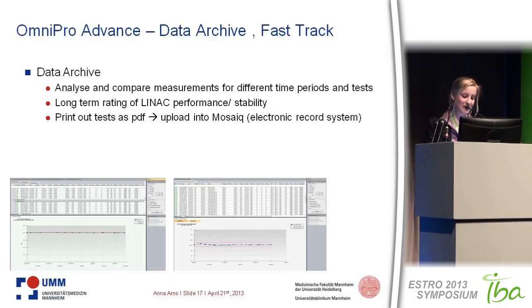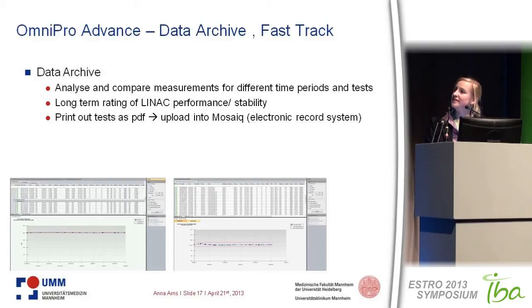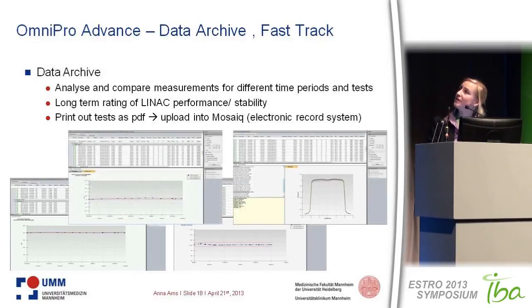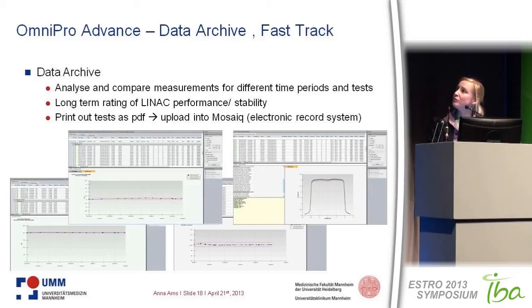At the bottom you can see two examples: the dose output, which is quite stable over the last three months, and the symmetry plot, where the red bars are the tolerances and the blue bars are your daily results. Another example is the inline profile, where we once had a failure in field size that was just on the border of tolerance. You can also overlay all profiles from previous measurements to compare stability visually.